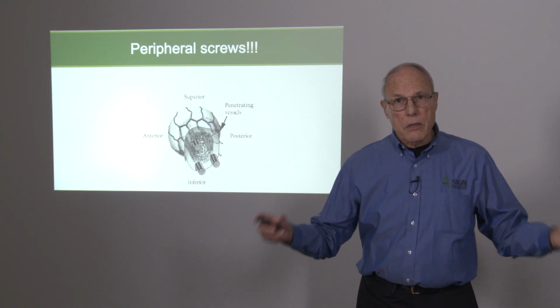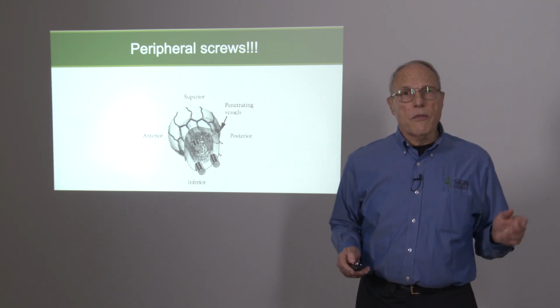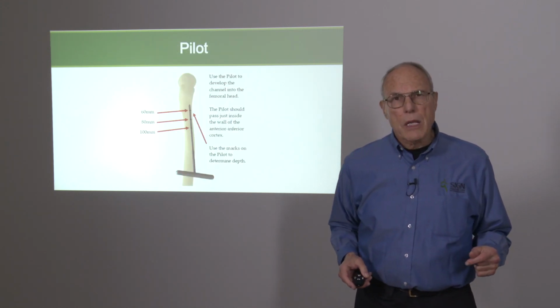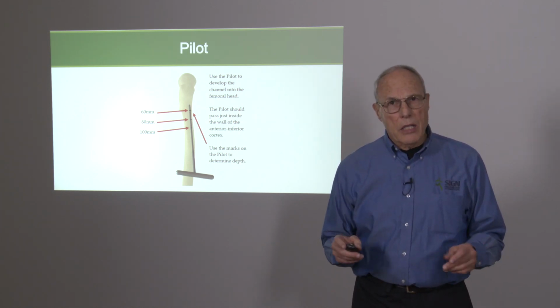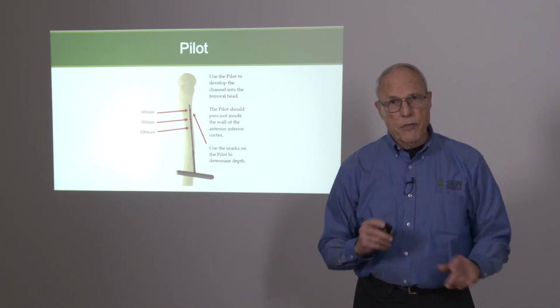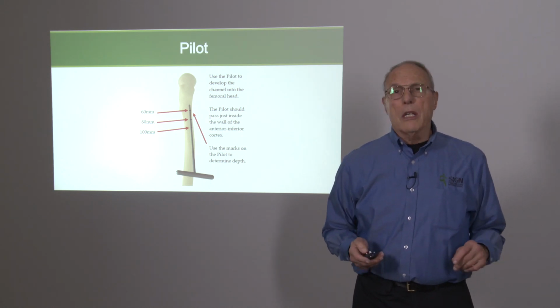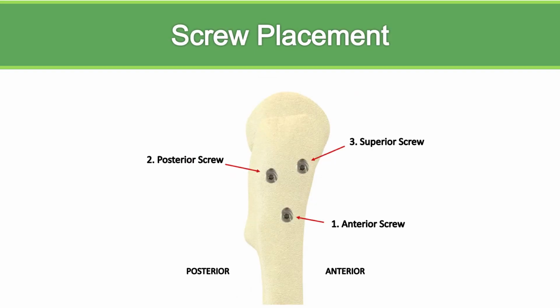There's a lot of differences of opinion, but probably most opinions say it should be in the form of an inverted V. Our pilot is very valuable because it's designed to provide tactile sense so you can make a tract up into the femoral head from the lateral trochanter, as in this one. It has marks to note the length of the nail, which should be determined before surgery by using the template. This is the inverted V configuration.